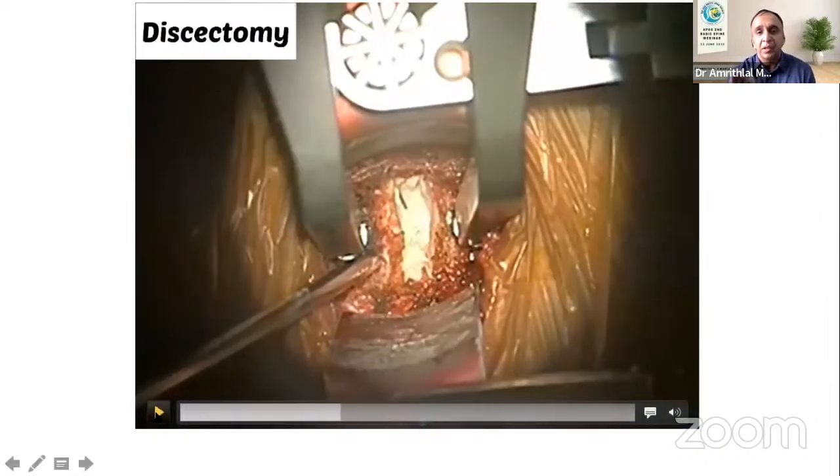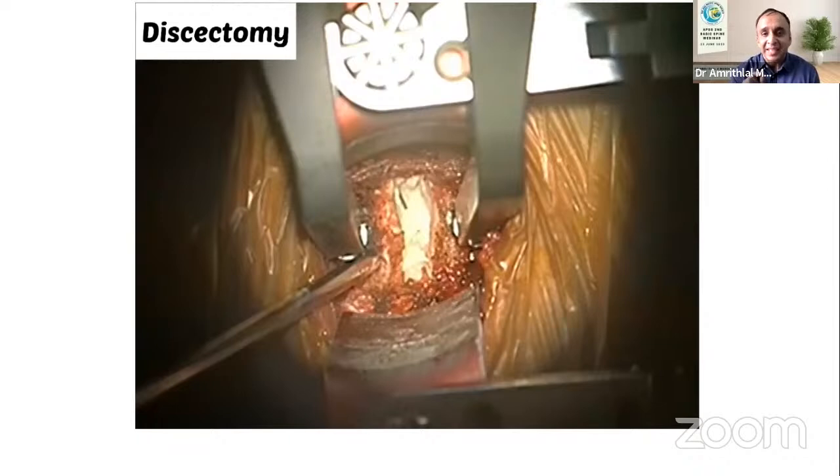At this point, I would like to say that it's very vital that you put the Caspar pins right in the center, in the midline. In order to put the pins in the midline, you should have exposed the upper lip of the vertebra well, exposed the lateral margins of the disc space. And I always partly do the discectomy so that I can identify the uncinate processes a little bit before I put the pins, on both sides, so that I can put the pins right in the midline. It's important to identify the midline because we need the arthroplasty device to be placed right in the midline. So start the discectomy, then put in the pins after identifying the uncinate processes.